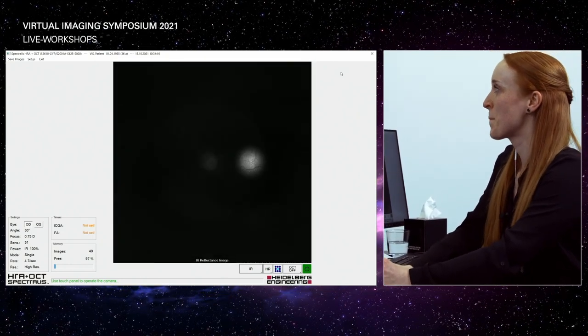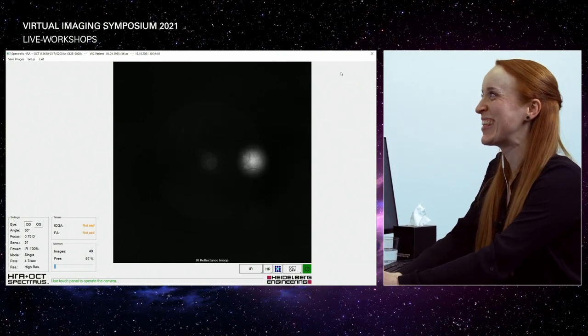So, okay, one last question, and we have 1 minute left. The question for this scan with many lines in a small region belongs to a star scan. Can you please show how to do a star scan with maybe 15 degree angle and many lines?